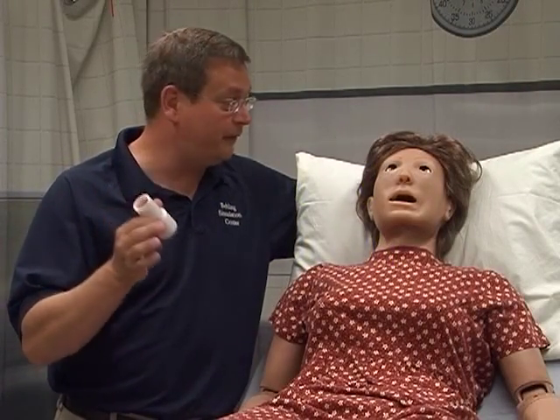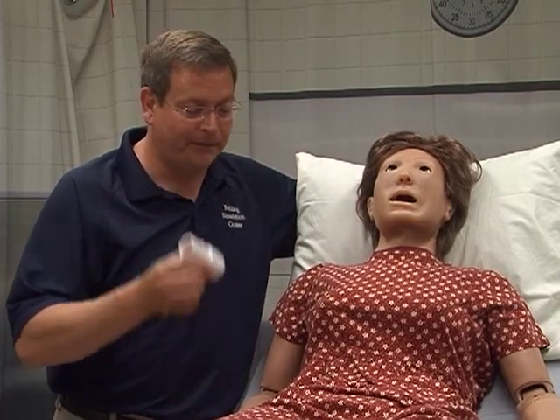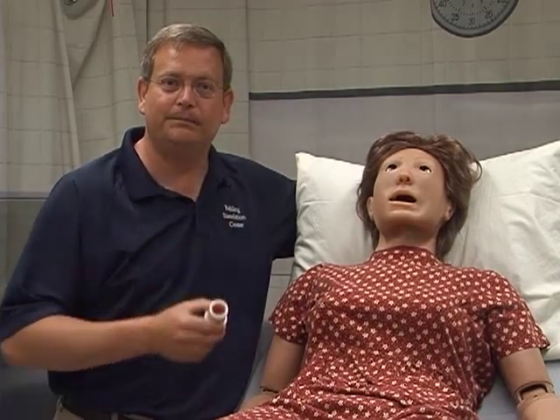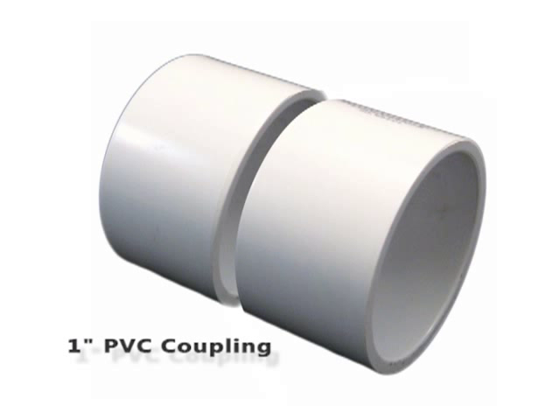Welcome to the bonus section. If you're lucky enough to have a Suzy like we do, we're going to show you how to take our model that we created earlier, get it into Suzy, and increase the realism for our learners. One additional piece of equipment you'll need is a one-inch coupling that you'll cut in half, which will be placed in Suzy to hold your uterus in place.